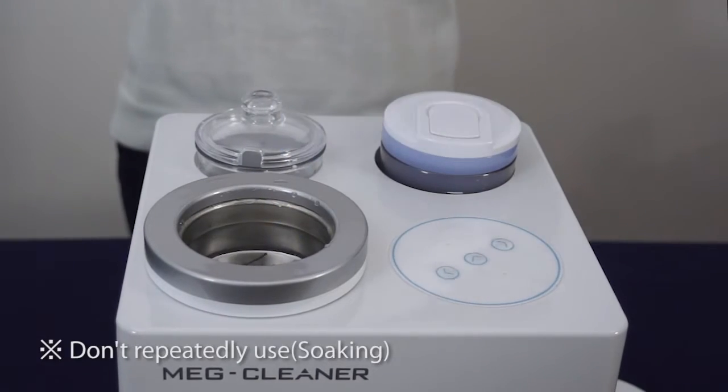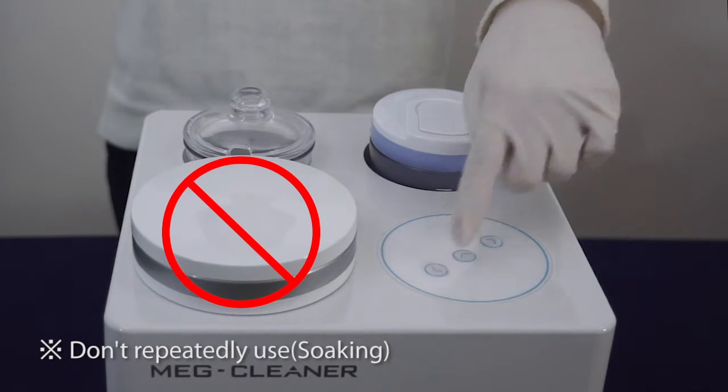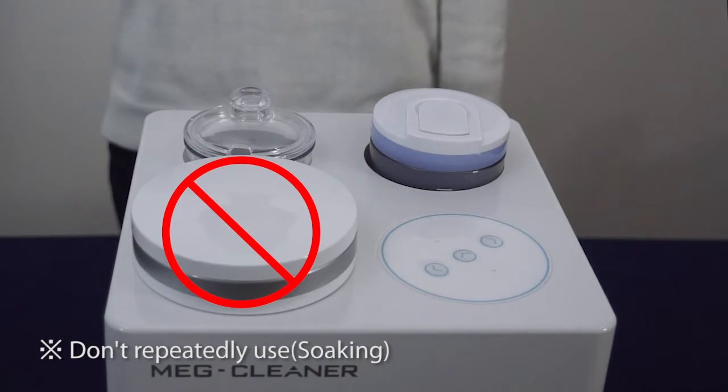The cleaner can be damaged if ultrasonic cleaning is done repeatedly. Please let it rest for at least 25 minutes before the next usage.